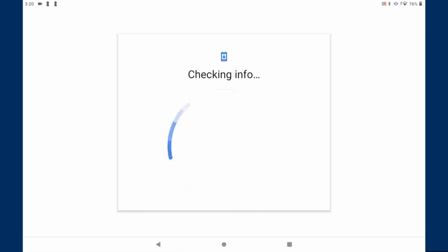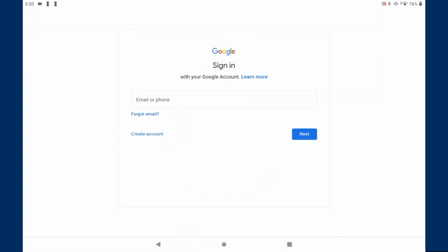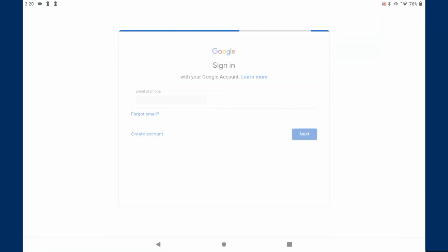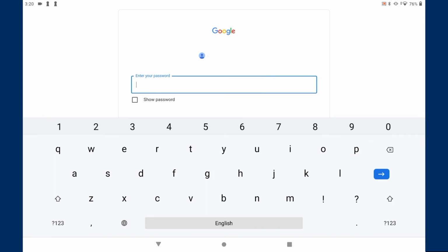Once a Google account is created, the user can use the Gmail account for emailing or sharing of files within the easyTone app. Google Play allows installation of other preferred sharing apps or to access an email account other than Gmail.